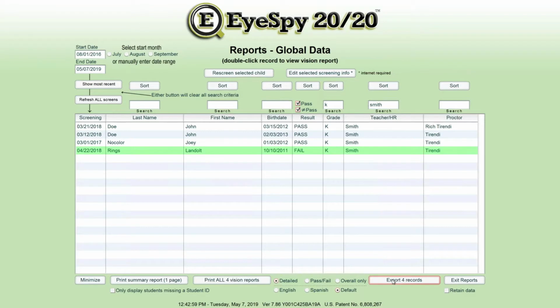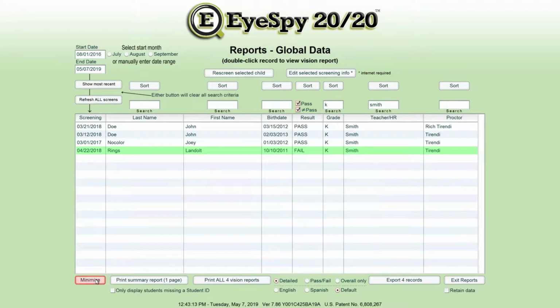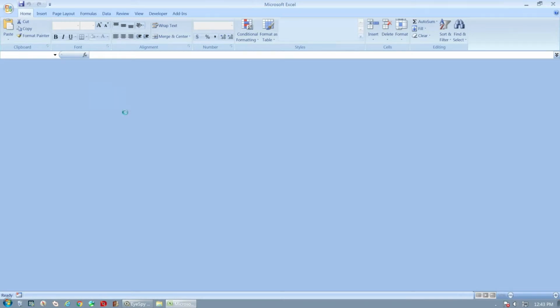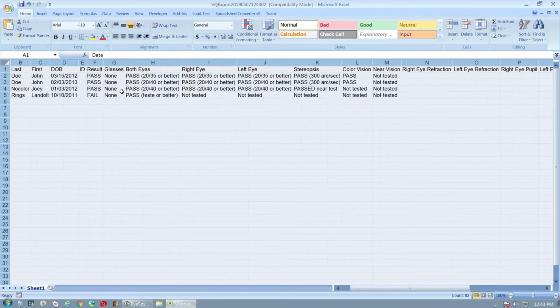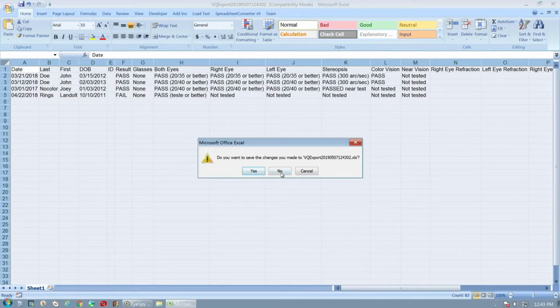The other thing that you can do is export the data into Excel. I don't have to show you what the Excel spreadsheet looks like, but you're more than happy to play around with it, or if you want me to do that, just tell me. What it does is put an Excel spreadsheet right on your desktop. If you have questions about what all the columns mean, we can have a conversation about that. But this is basically all of the information that was collected in the report. So this can actually be imported into your electronic health record system if you wanted.